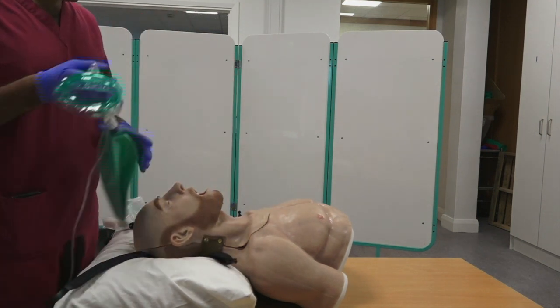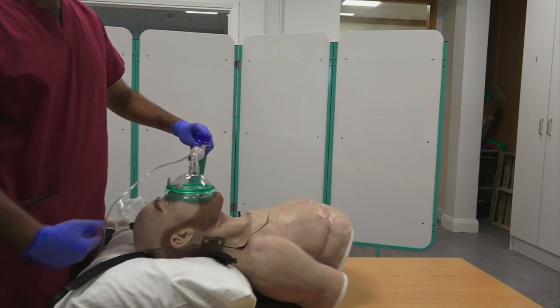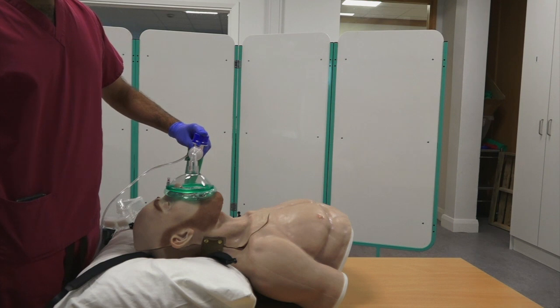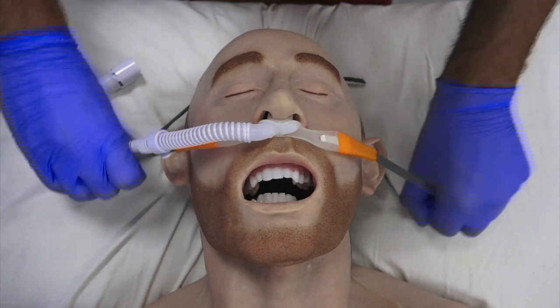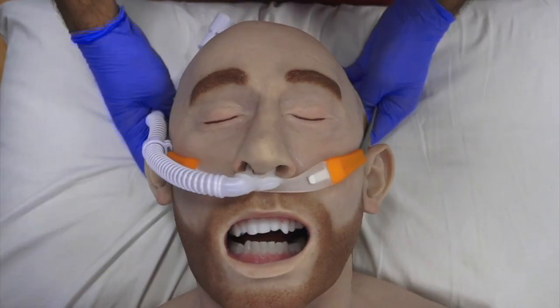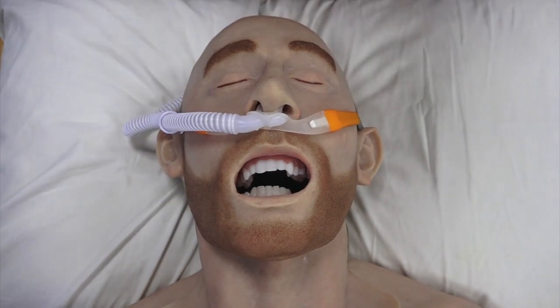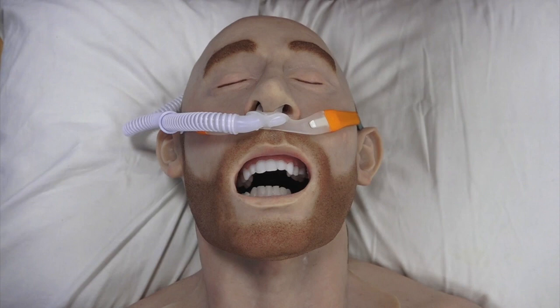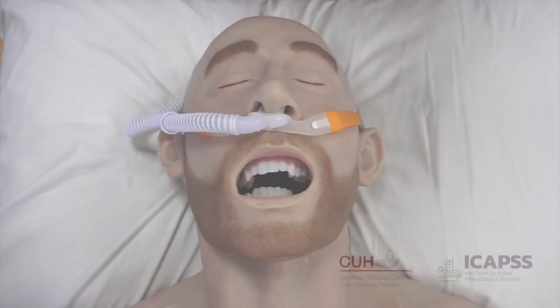Pre-oxygenation can also be accomplished by applying a tightly fitting face mask attached to a manual breathing circuit supplying 100% inspired oxygen. High flow nasal oxygen at a flow rate of 30–50 liters per minute of 100% oxygen can also be used. The advantage of this technique is that high flow nasal oxygen can be continuously given during intubation attempts, providing per-oxygenation as well as pre-oxygenation. If available, target end-tidal oxygen concentrations greater than 85%.